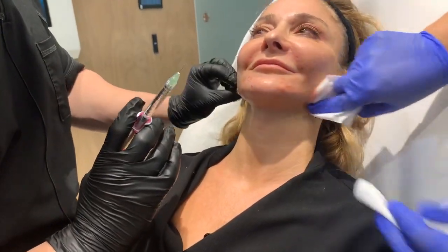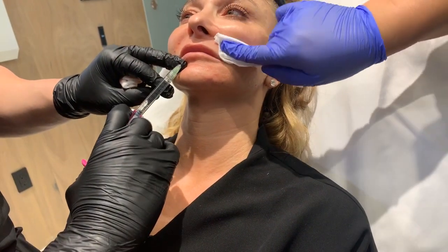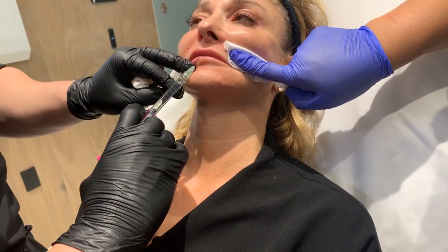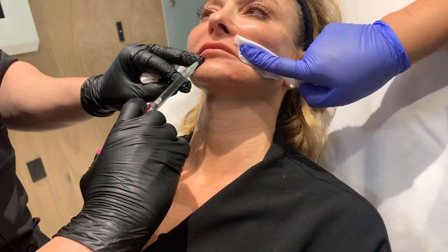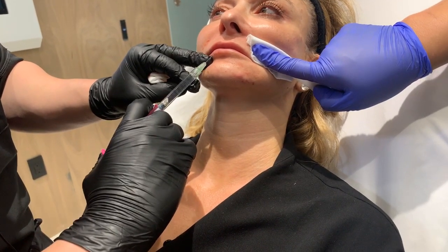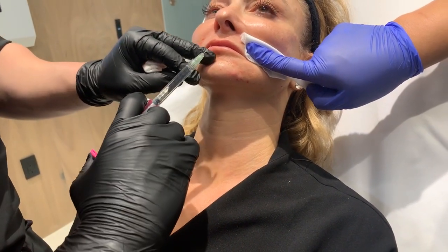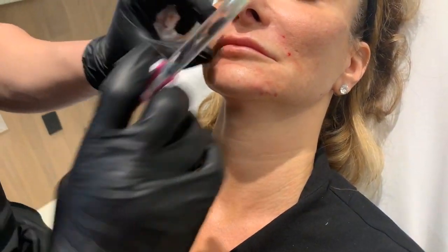Dr. Emer, why Juvederm Velour? Why not? I love it. It's very soft, it's natural. And now for her lips, she's got little baby lips, so we want to make sure we keep them nice and cute. Her lips are a little longer, which is okay, so we're going to kind of move our way all the way down very subtly. You can see already, take a look what it looks like when you do a little plumping at the border.